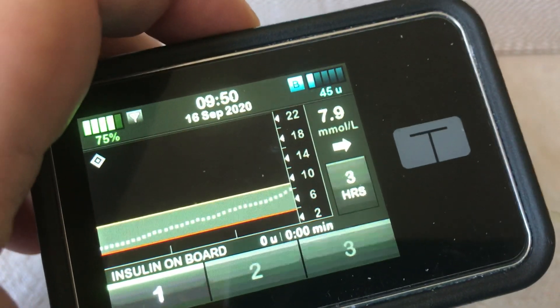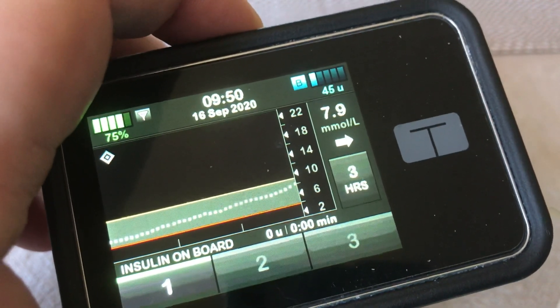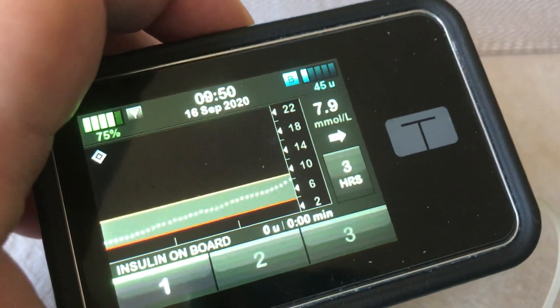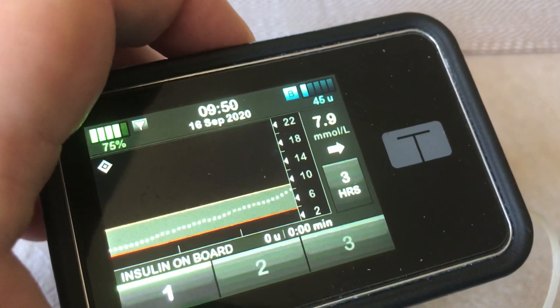There's not enough insulin in the pump to last me till tomorrow morning, or throughout the day. And I need to do — I'm just going to do a little top-up so I know it will last me till tomorrow.